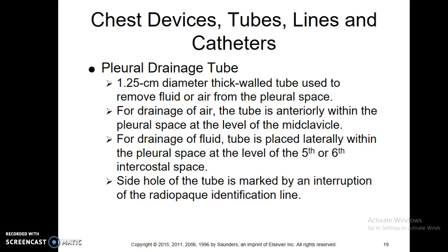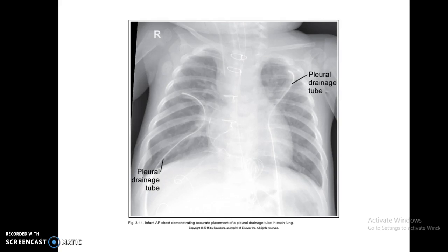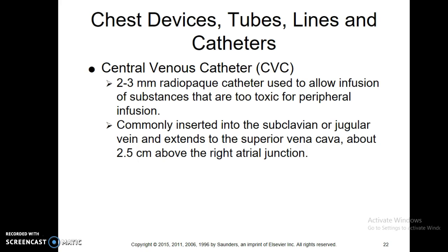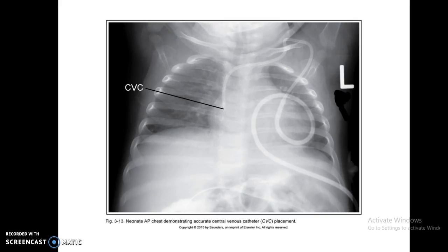Drainage tubes you can look over on your own. Here are a couple pictures showing bilateral drainage tubes on an infant. For a CVC, you can see that towards the middle on the right side. You want to make sure it doesn't get all bunched up on a baby, and it should be towards the right side with accurate placement.